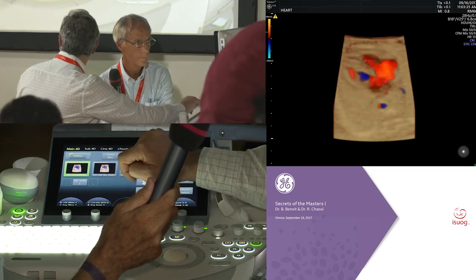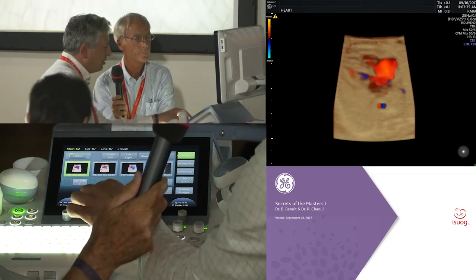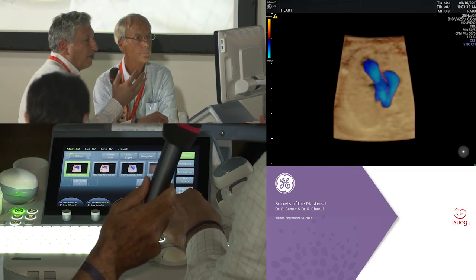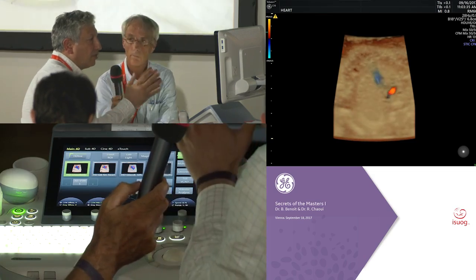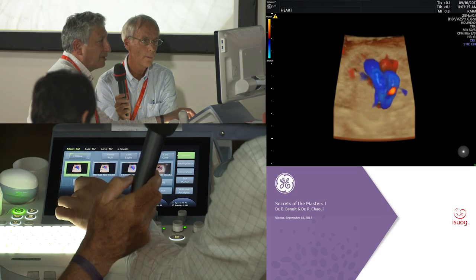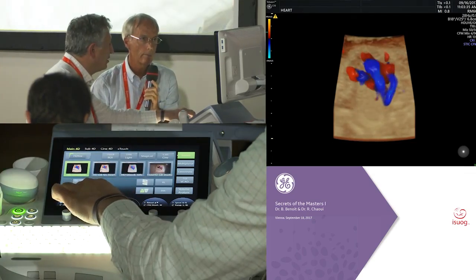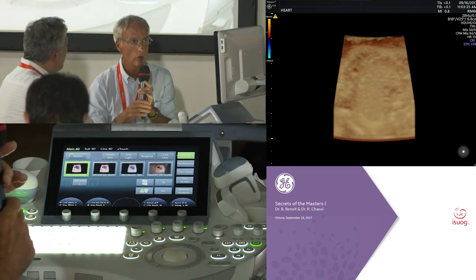Hit here. You have color coming 50-50. And then if I go higher, it will still be hiding somewhere in the volume. And if you want to see all, you add color here to 100%, and the vessels are appearing. Another way is what I learned from Bernard many years ago is to cut the upper part. Yes, but maybe we will show it tomorrow.